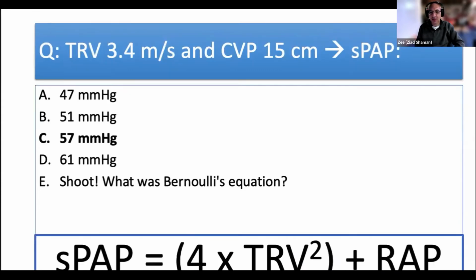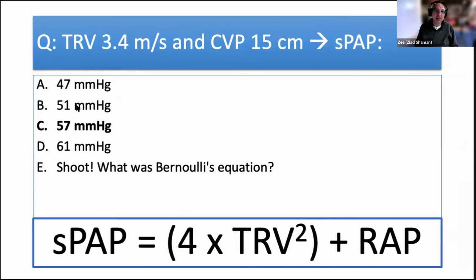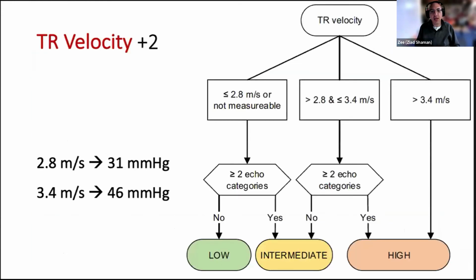So this is a measurement problem that I face a lot in the ICU when I'm measuring the CVP, and I don't know if the report being given to me is in millimeters of mercury or centimeters of water. Does it make a big difference? Probably not. 4 millimeters is okay within the measurement error anyway of ±5. Okay, so now, instead of using, what is this?